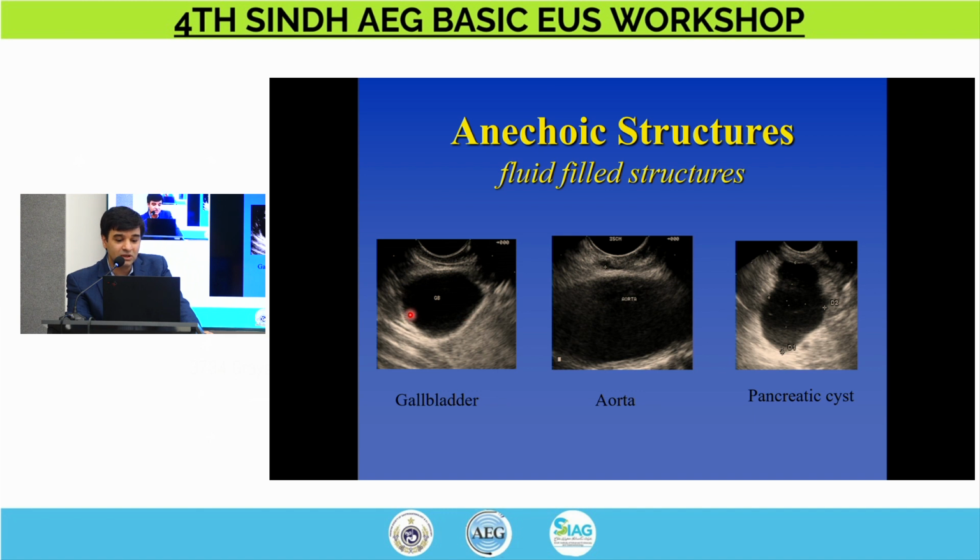So this, for example, is a gallbladder. I know it contains liquid. I know there's acoustic enhancement under it that looks like a cone. This, as another example, is the aorta. And here you're seeing a pancreatic cyst with a little bit of mud-type material under it.